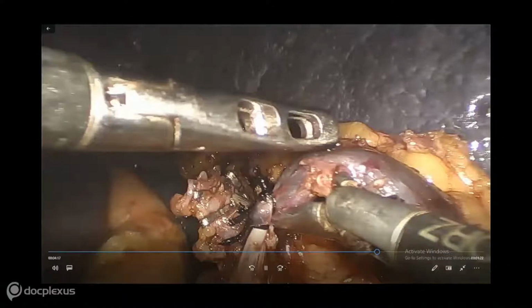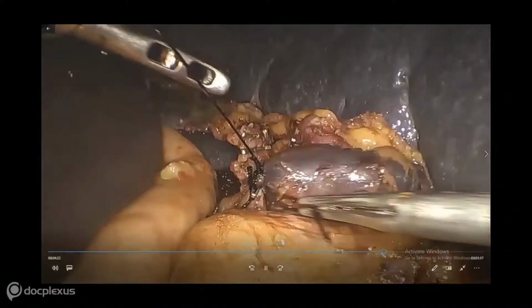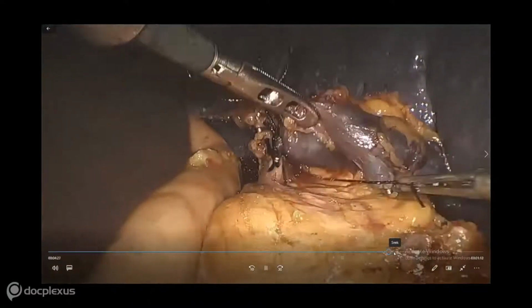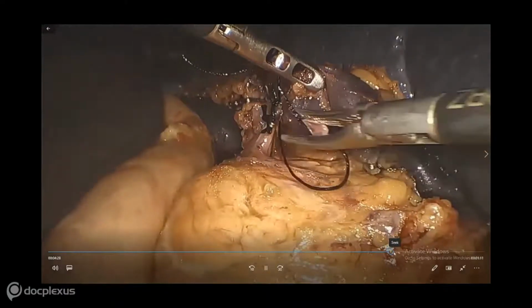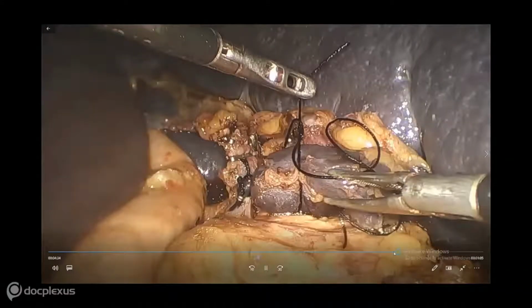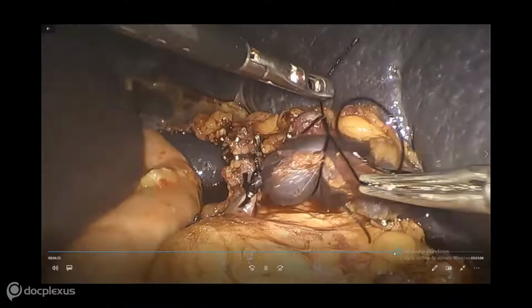So we have already done 2 ligatures. The artery has been divided, and we are dividing the splenic vein. Once that is done, what remains is only the division of the lateral attachments, which is very easy. We can divide all attachments to the kidney as well as to the diaphragm.